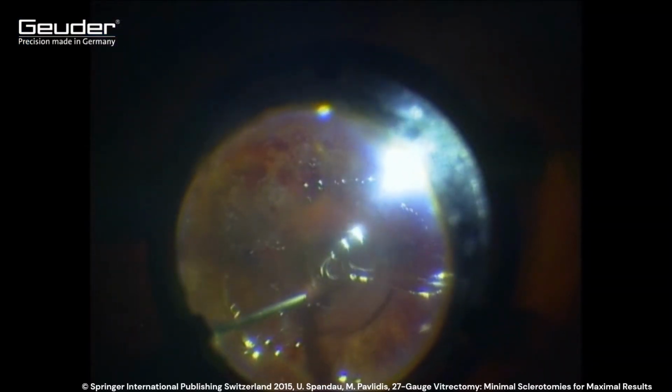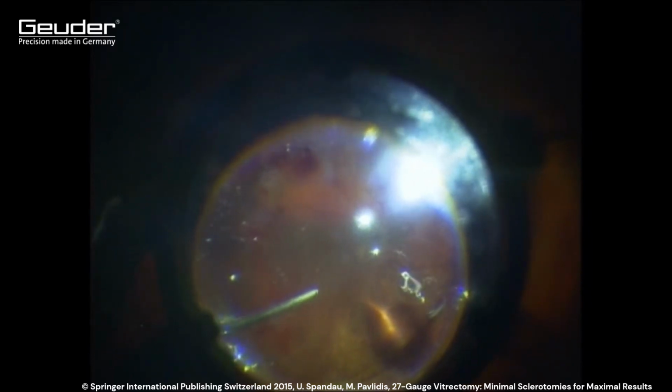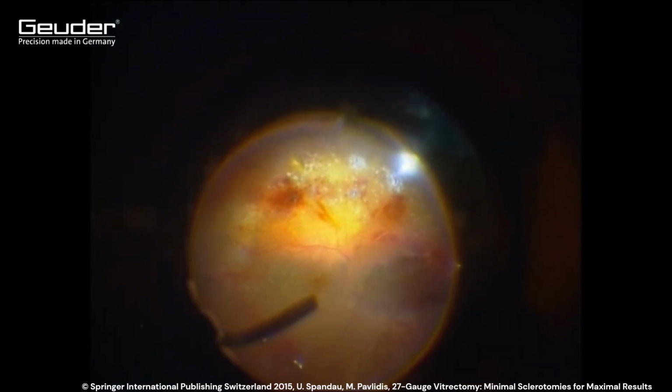This video shows the entry of silicone oil into the eye. On the left in the picture is a backflush instrument that implements the aspiration.